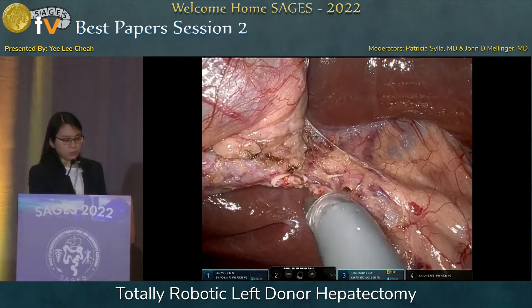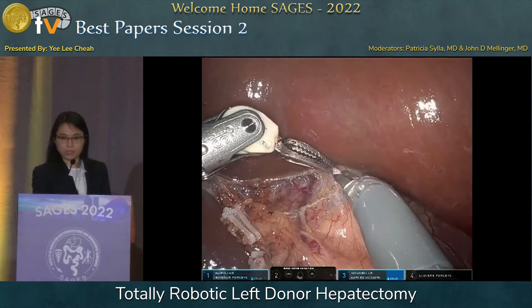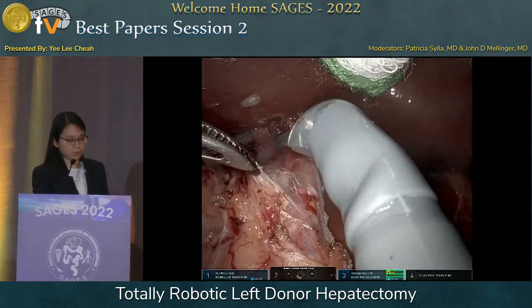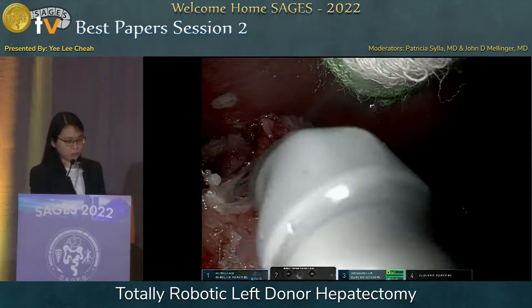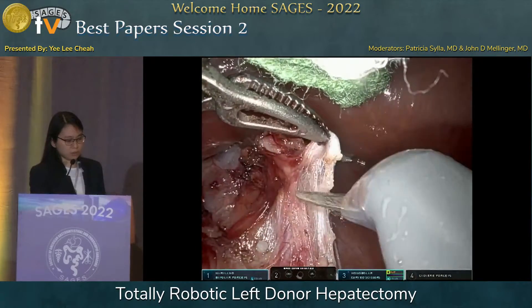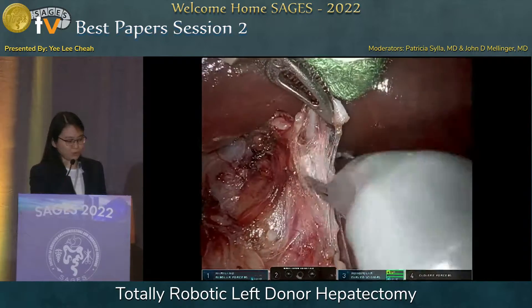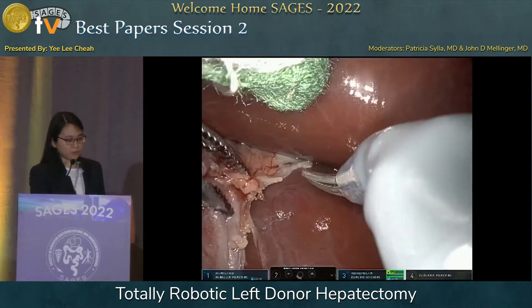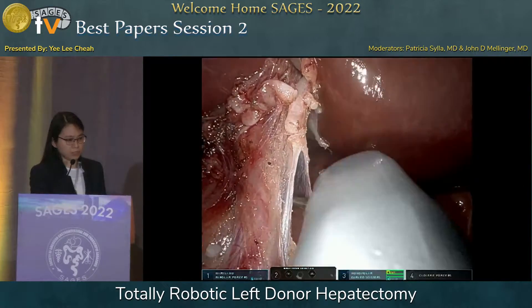We then turn our attention to the hilum where a cholecystectomy is performed, and then move our dissection towards the left side of the hilum in order to locate the left hepatic artery and the left portal vein. You can see the left hepatic artery there. Careful dissection is performed in order not to injure it, and using robotic technology allows us to carefully dissect each nerve and lymphatic channel from surrounding the left hepatic artery. We try to provide the recipient surgeons with the whole length of the artery if possible to facilitate their vascular anastomosis.